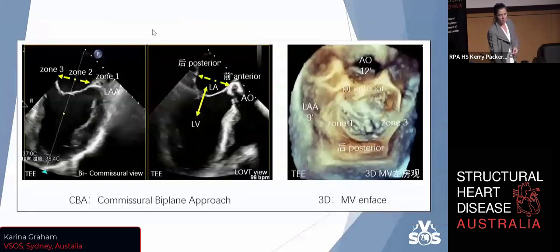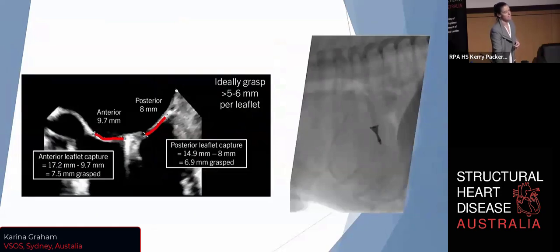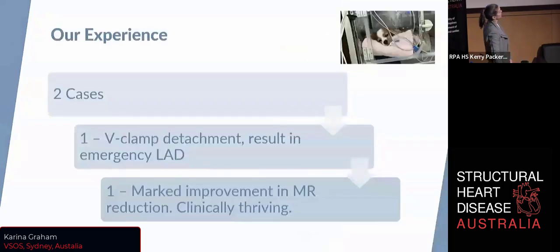So the imaging is very similar to what you're used to, and that's for us getting our eyes used to looking at both screens. And this is handheld. We're literally resting our hands on a towel, and so trying to get that axis point correct, rotation correct, is, I think, very tricky but exciting. And then when we deploy, we have to wait very steady and hear from the echo team that we're doing the right thing. We've got enough leaflet, and then it looks like that picture in the end once it's deployed. So we've only done 2 cases.